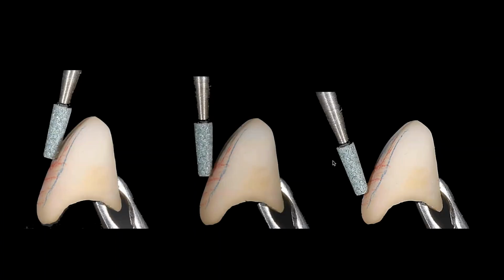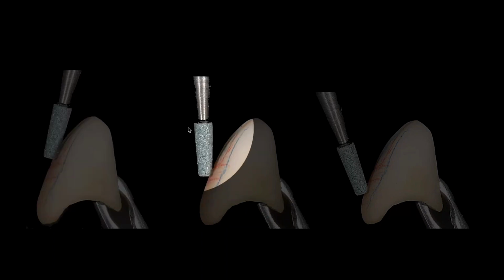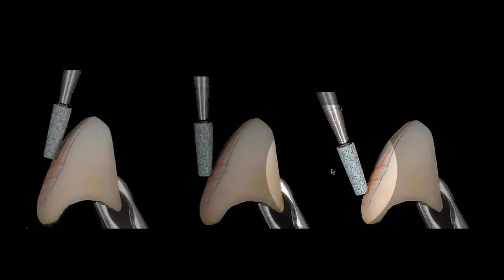Part of the reason for that actually comes from a great book from Kataoka. Kataoka talked a lot about understanding not only the surface, but understanding angulation. So what I mean by that is if I take something that has a flat top to it and a surface kind of an L looking, well, the angle that I hold that on as I'm digging into my tooth creates one thing. If I change that angle, it creates something different. And the more I change that angle, the more I'm able to change. So even with a normal burr, just the ability to sometimes change the angulation of how you're working through it really changes the effect of what the restoration is going to look like.